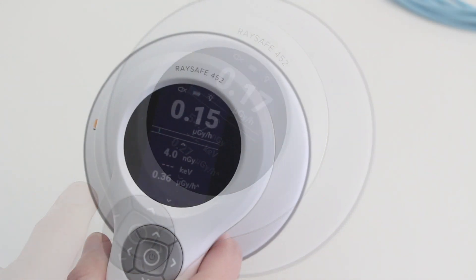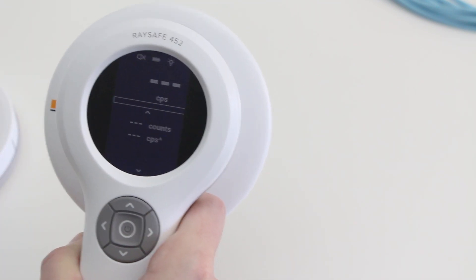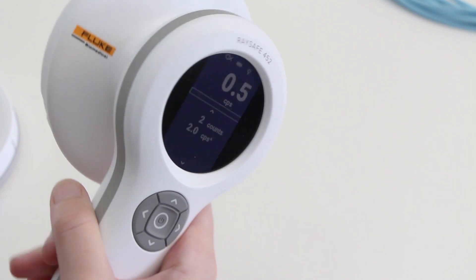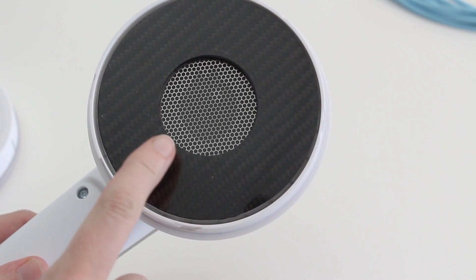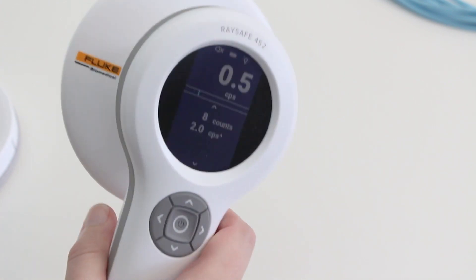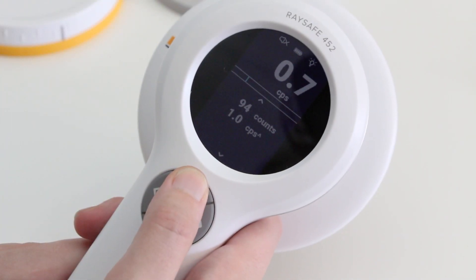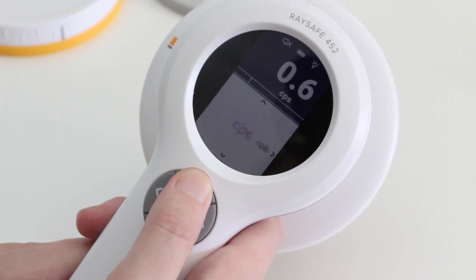To measure counts, you take the lid off. The quantity automatically changes to counts without any manual settings. The active sensor area is now limited to the steel grid which protects the Geiger-Müller pancake. The counter can measure in counts per second or counts per minute.